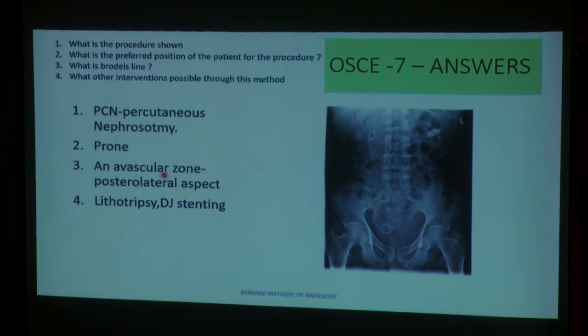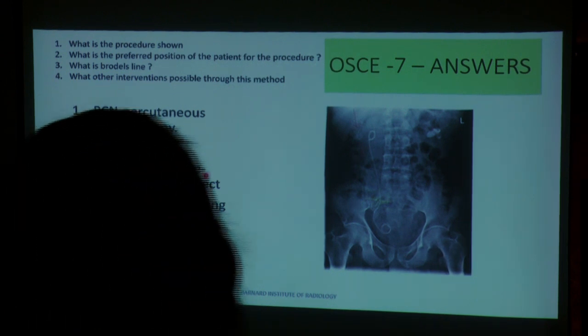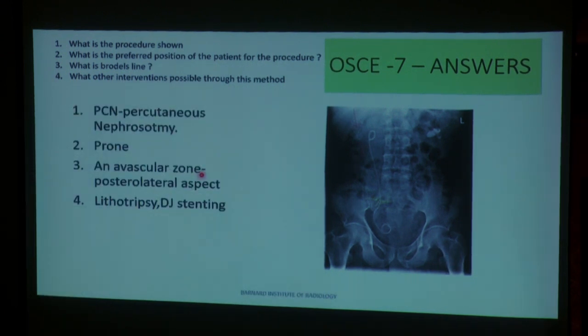So that is why we take a posterolateral approach with the patient prone. It is just an imaginary zone, you cannot see it, but we try to get into the posterior calyx rather than the anterior calyx for drainage.